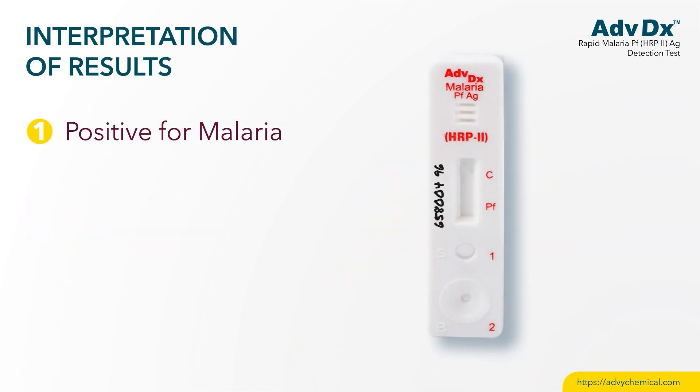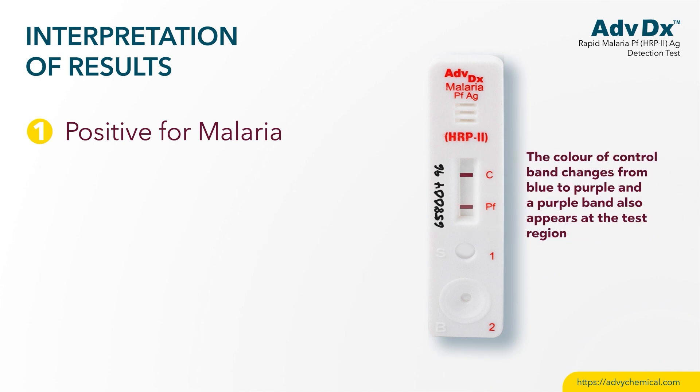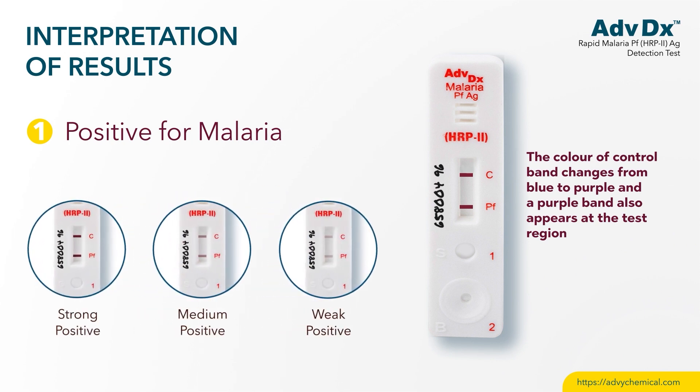Interpretation of results. Positive for malaria: if two bands appear, the test is positive for malaria PF infection. The intensity of the test band may vary depending upon the concentration of analyte — strong, medium, and weak positive.